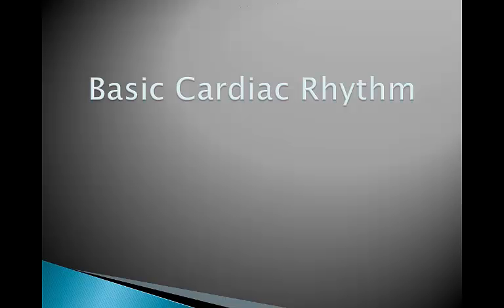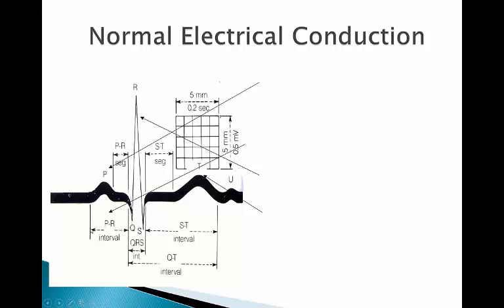All right, so we're going to talk about some basic things related to cardiac assessment. And then in the second, third, and fourth podcast, we're going to talk about the dysrhythmias. If you've ever seen a telemetry monitor, and if you haven't, then when you go to clinical next, you need to make sure and look at this. You're going to see things that look like this. Or, when we're in sim, if you ask me, I'll be happy to show you on the monitor as well.